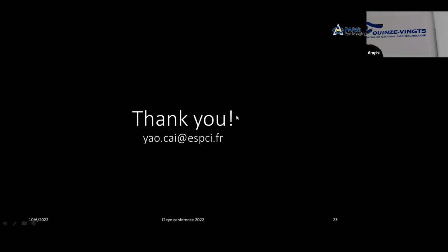Maybe the X motion might be related to the rotation of the eye. Actually, this is a very interesting question, because when we performed the experiment, we didn't consider the eye motion. We had a fixation target to ask the subject to stare at, when we measured the X motion in the HD-OCT. So maybe this might be interesting for further investigation.